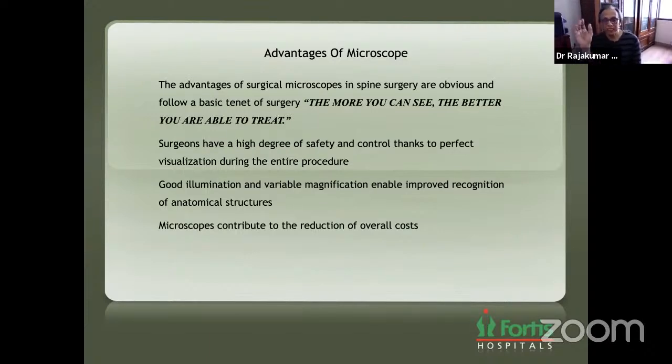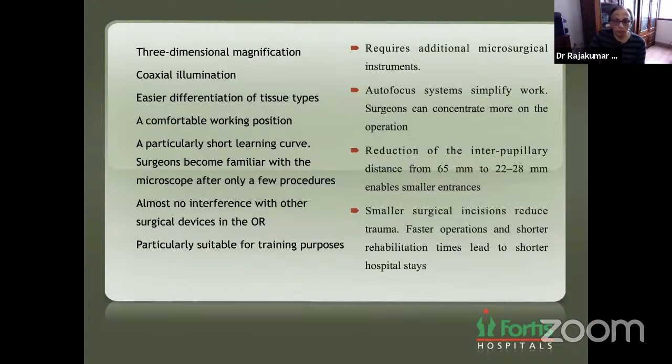The whole idea is the more you can see, the better you're able to treat. So basically, you have to have a high degree of safety and control on what you see and where you see. And therefore, good illumination and variable magnification will actually make your patients do better. So microscopes give three-dimensional magnification, illumination, et cetera. The whole list of advantages.